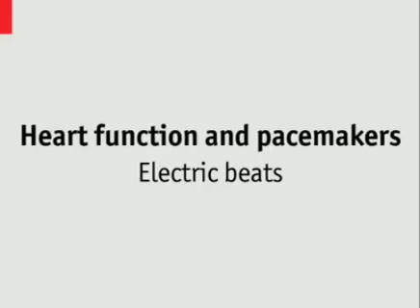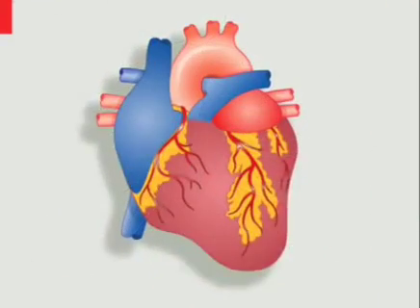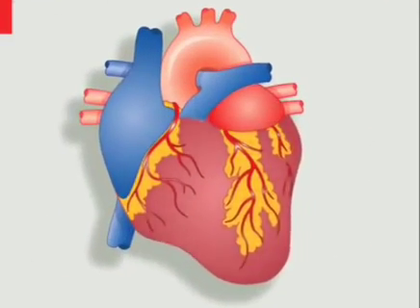Implantable pacemakers and defibrillators are devices that apply electric shocks to maintain the rhythm of the heart and, if necessary, restart it. As the technology improves and the list of treatable conditions grows, the number of devices being implanted is increasing steadily and now exceeds 500,000 a year.